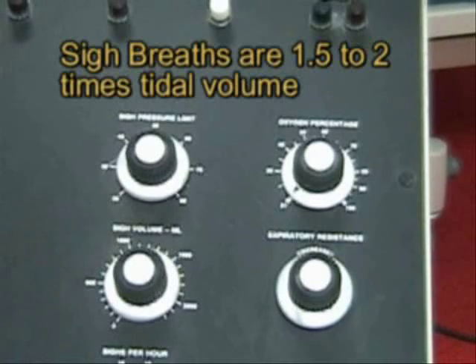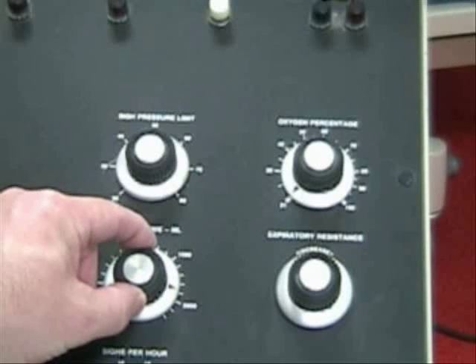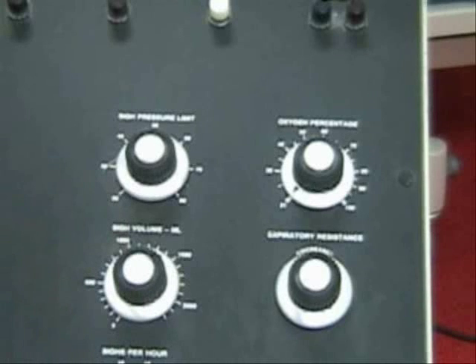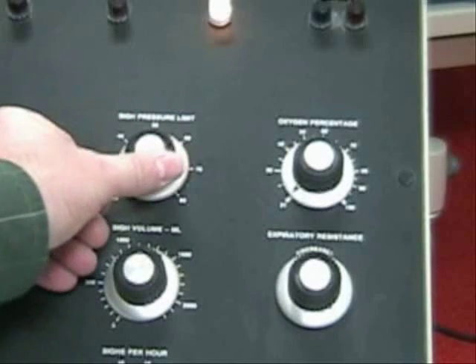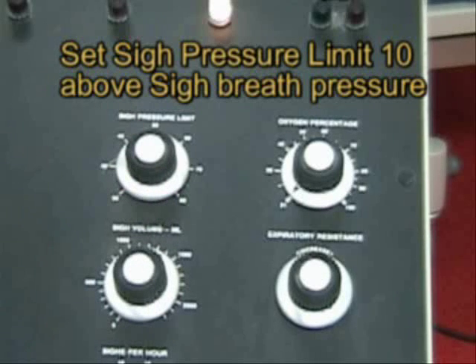Sigh breaths were used to help hyper-expand the lungs to avoid atelectasis, and typically they were anywhere from one and a half to two times our tidal volume. So if we were delivering 900 mL tidal volume, we may see a sigh as high as 1800 mL — more typically around one and a half times, or about 1400 mL. Because the sigh is a bigger breath, it may cause an alarm when it reaches too high, so we have a separate pressure limit. If the sigh breath goes up to 40, we set our sigh breath pressure limit to 50.